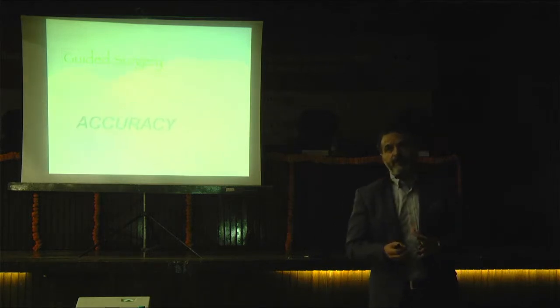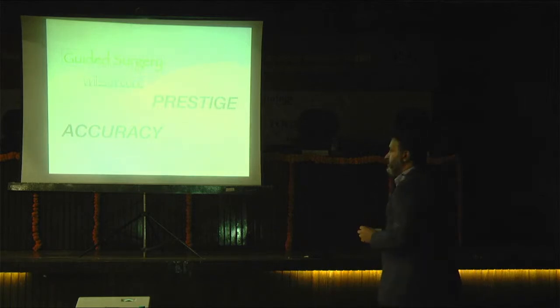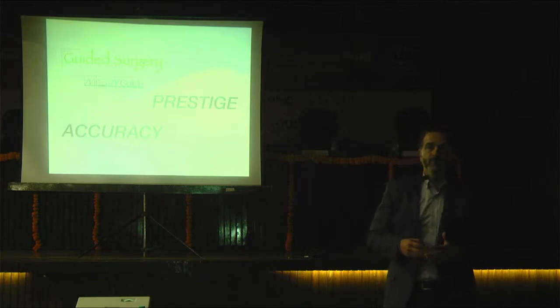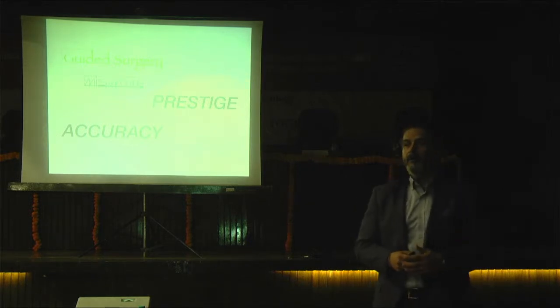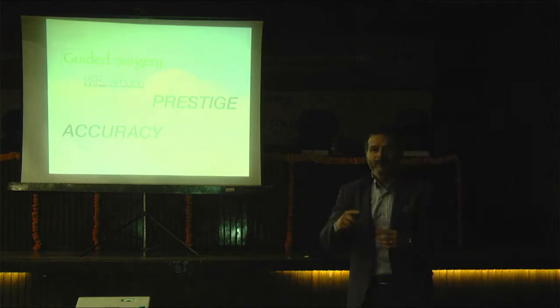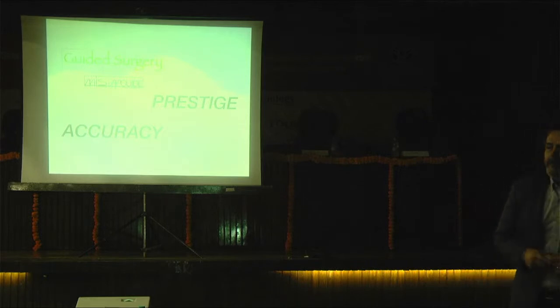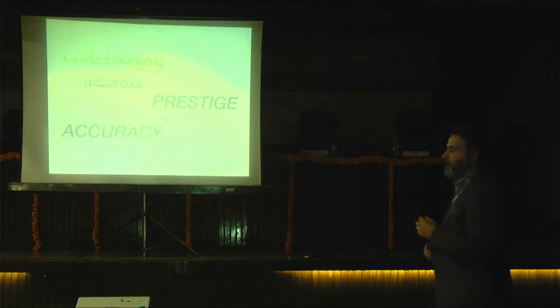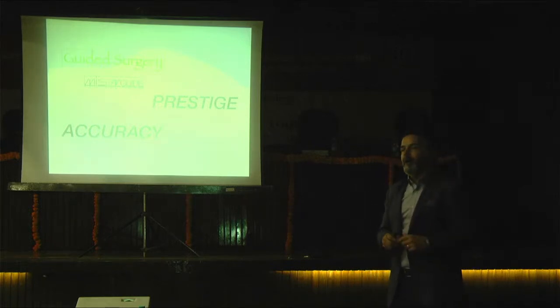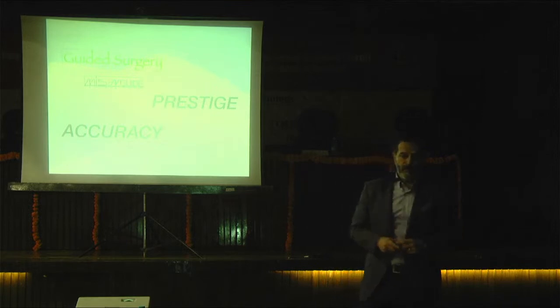Guided surgery is prestige. And the brand I'm going to tell you about is the Dentsply Sirona product, which we call M-Guide. I mean, guided surgery, but with a one-letter prefix to the word. So this is what we call M-Guide, which is the most well-known guide in the world, not just in Turkey, not in any other single country.